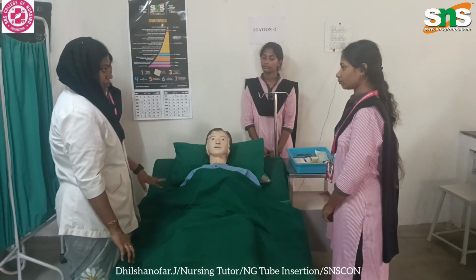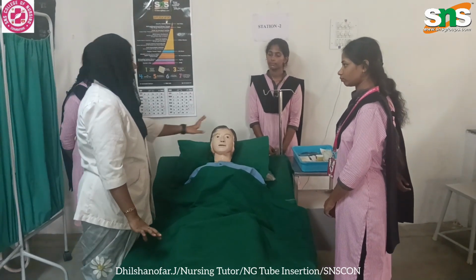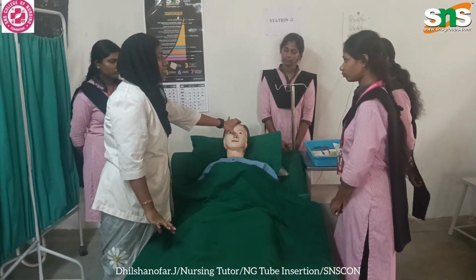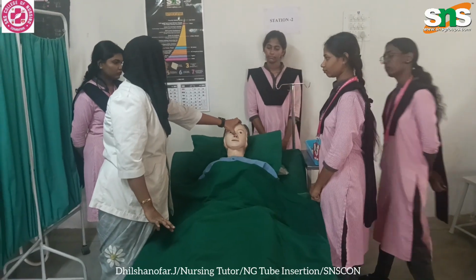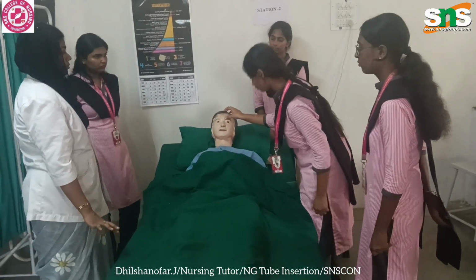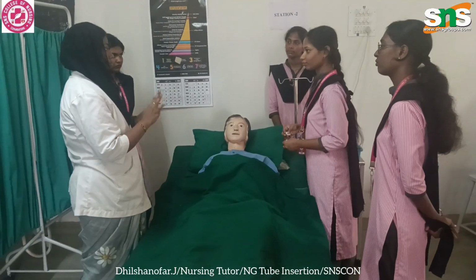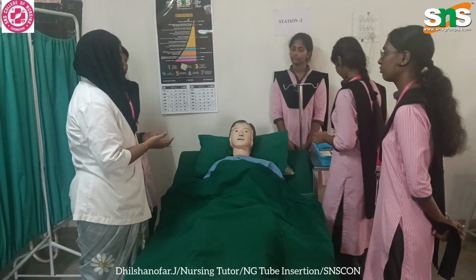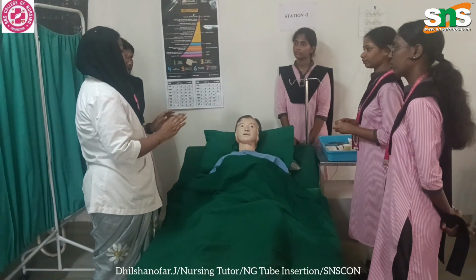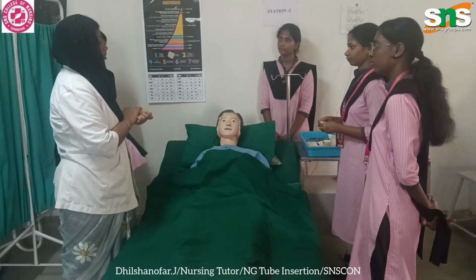After placing the patient in upright position, you have to check the nostrils, whether they are clean and clear or not. Before the procedure, you have to do hand washing. After hand washing, wear the gloves.